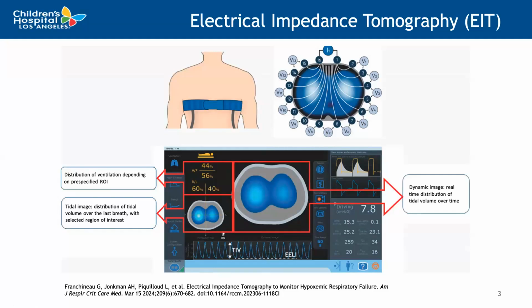As part of the technology, it comes with an inline flow sensor. So this is attached directly to the endotracheal tube. And this allows us to not only see ventilation, but also pressure and volume measurements, as well as the machine itself is able to calculate different lung metrics, such as driving pressure, the PEEP, the PIP, as well as intrinsic PEEP. If this patient had an obstructive process, you can also start to see measurements of compliance, resistance, and then the tidal volume.